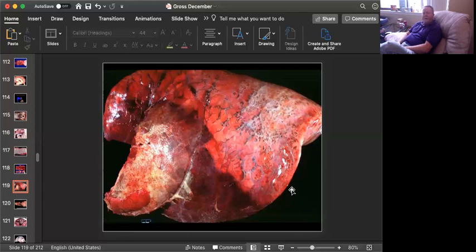I'm going to mention Mycoplasma bovis, which can give you a similar look. It often looks a little bit different because it really likes airways. You get a lot of bronchiectasis. Sometimes when you cut through these, you will see that the airways look like little golf balls because they're so full of exudate and they're so swollen. But I got to add Mycoplasma bovis to this, a disease that a couple of years ago was emerging. Now it's spread across Canada and the US, and everybody sees it now. So I'm going to add Mycoplasma. So now we have 4.